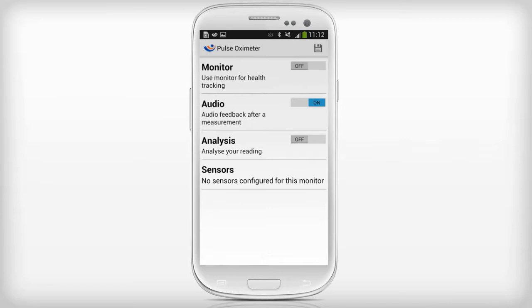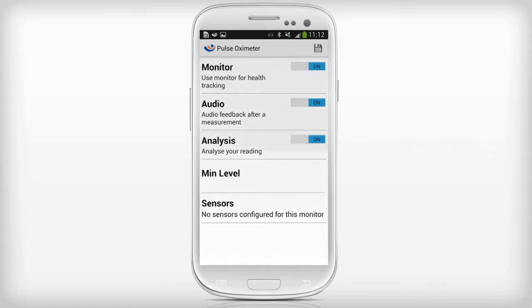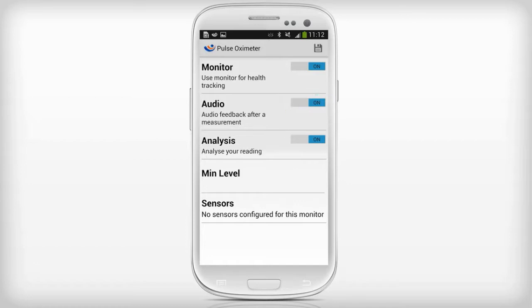In the pulse oximeter screen, set monitor to on. Set the audio on if you want audio feedback. Set the analysis on if you want MyFitness Companion to analyze your readings.